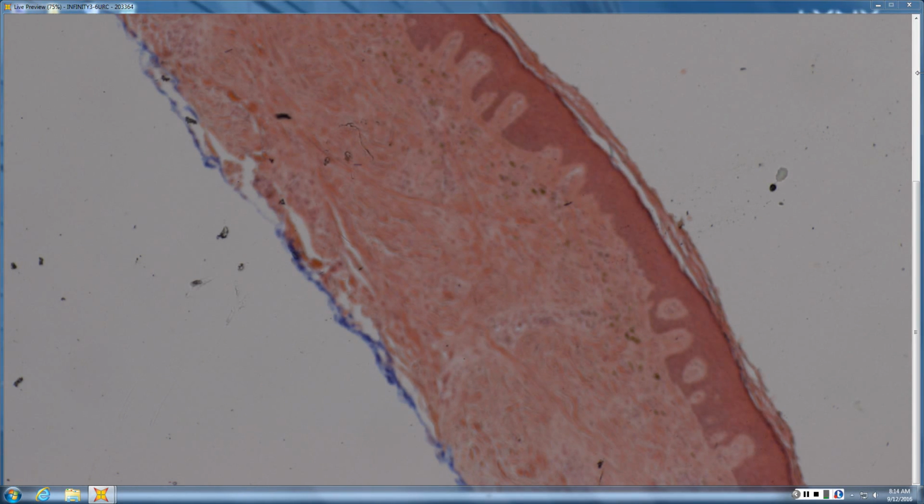Mm-hmm. If this were desmoplastic melanoma, any hints you'd expect? Maybe some nodular lymphoid aggregates. Yeah, exactly, something over the top in the DEJ. So if you're lucky, a little subtle lentigo maligna at the DEJ, but often you don't see it. In the dermis, nodular perivascular lymphoid aggregates, or any spindle cell proliferation buys you a SOX10 or S100, right, to rule out desmoplastic melanoma. We don't see either of those here.